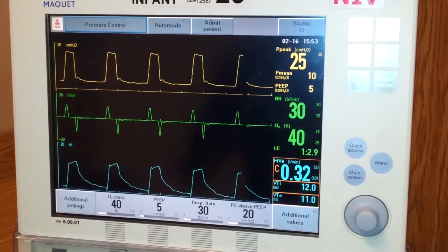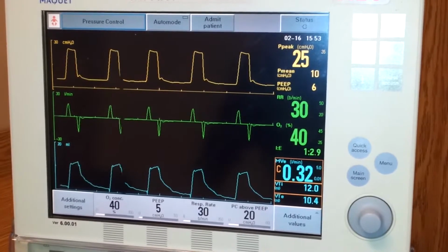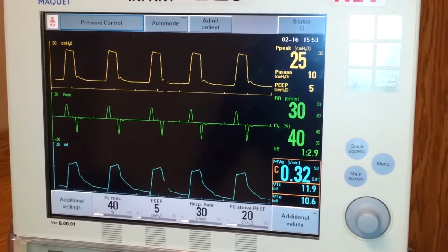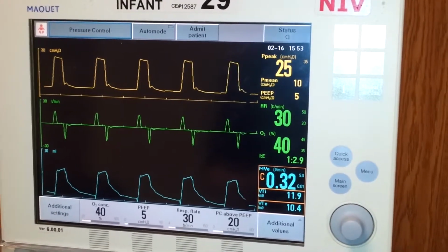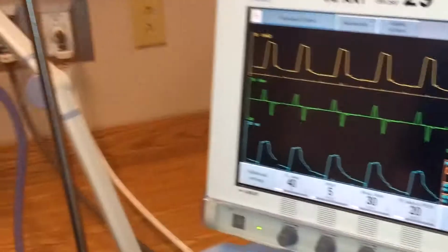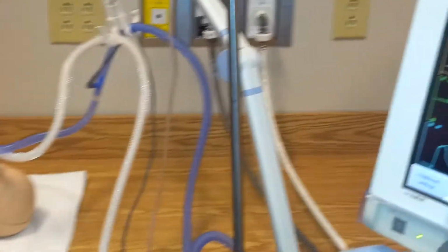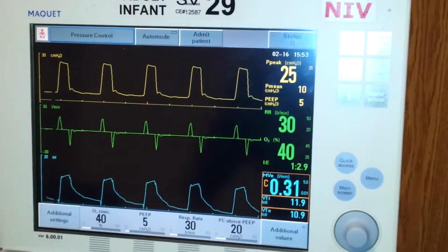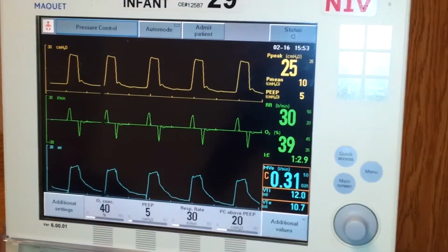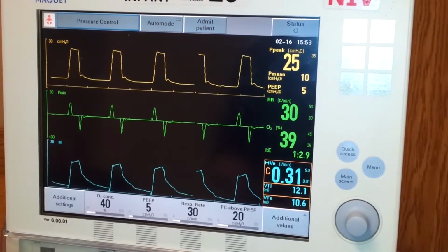Okay, so back to how tubing compensation works. If a ventilator is not tubing compensated, the amount of volume that the ventilator sends is not actually what the patient will receive. Some of that volume will be lost to the tubing. A lot of the new ventilators, like the Servo I, will calculate the tubing compliance for you in its pre-use check and send extra volume to compensate for what's lost to the tubing. The volume that actually makes it to the patient is known as effective tidal volume.